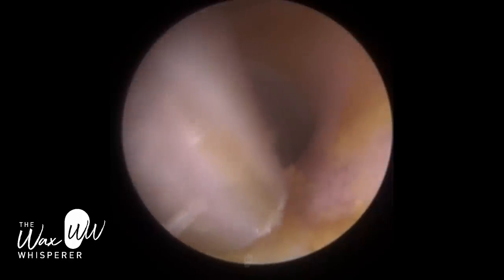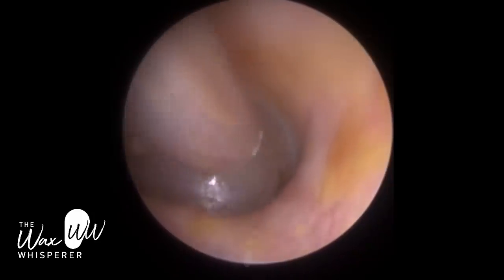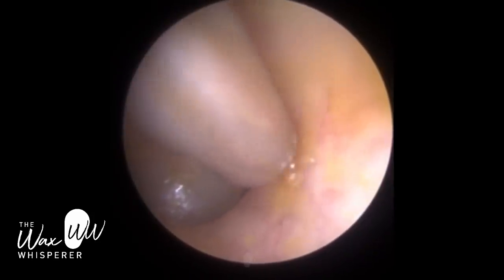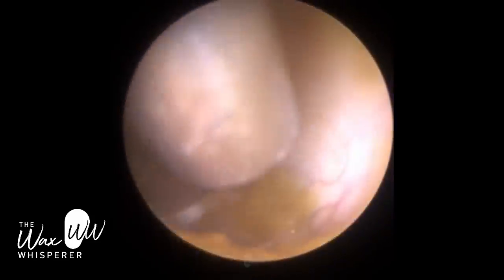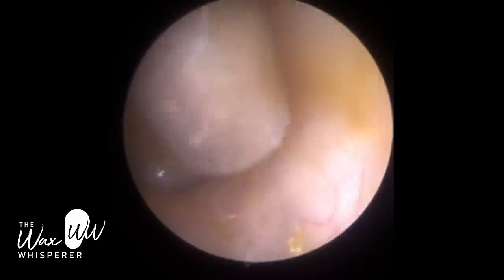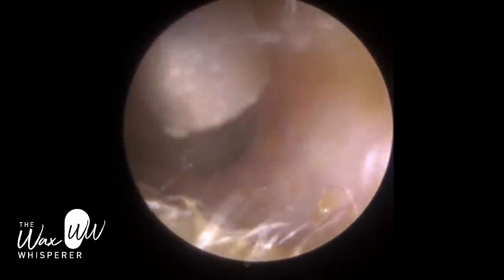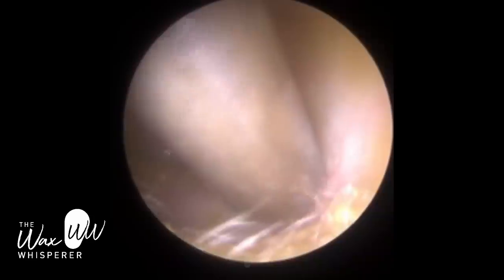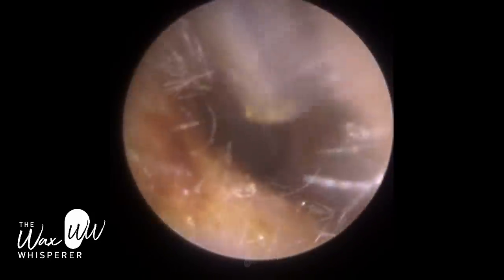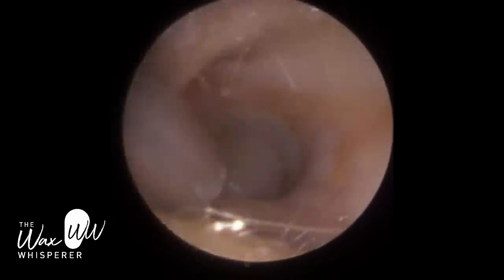I'm just mopping up near the entrance, having resorted back to the full Zolnir suction probe for greater surface area. With the fine end tip, the internal diameter of the suction tube — the lumen — is 1.27 mm, as opposed to the Zolnir suction probe which has a 2 mm lumen, almost double the surface area. It's just perfect for soft wax like this near the entrance on the cartilaginous portion of the ear canal.